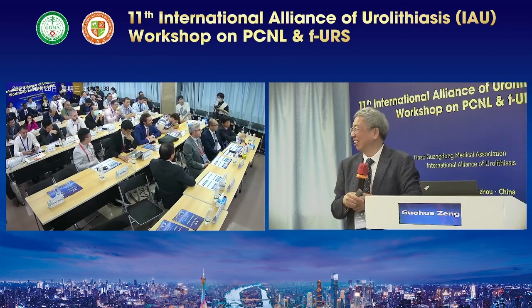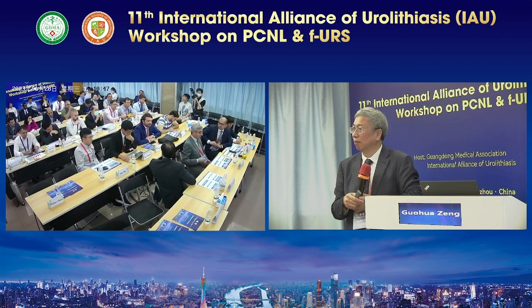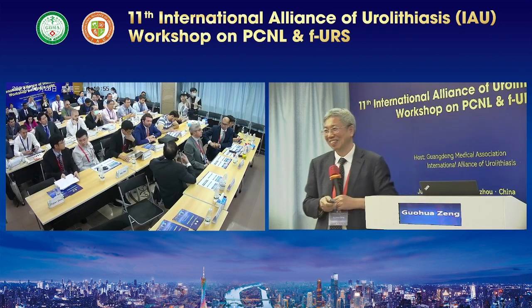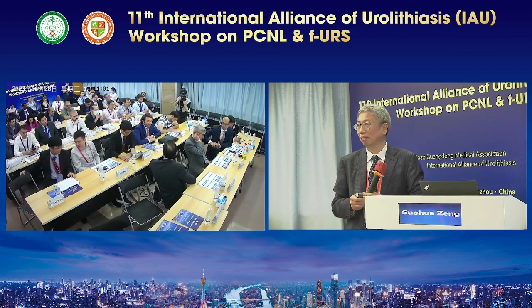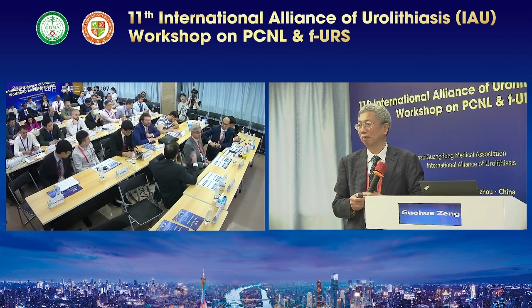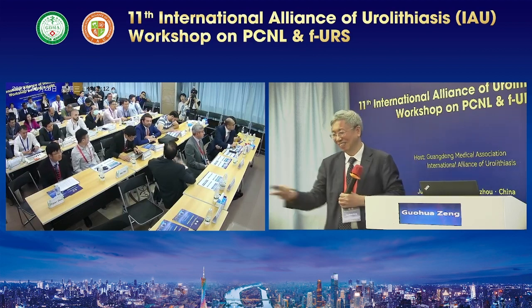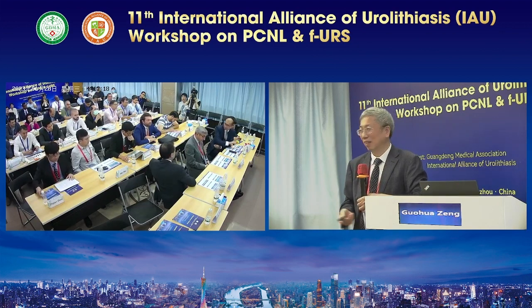So what's your practice then? Do you do a dipstick on the day of surgery? We definitely do urine cultures, and if they are positive, we will treat until they're negative before we do the operation. So it's slightly different, we are ultra cautious, but we think it's worth it because we don't want the patient taking the risk of severe complications. But everyone in the world has a slightly different practice. There's no right, there's no wrong. You just have to decide what you want to do for your practice, and you need to be able to justify it.